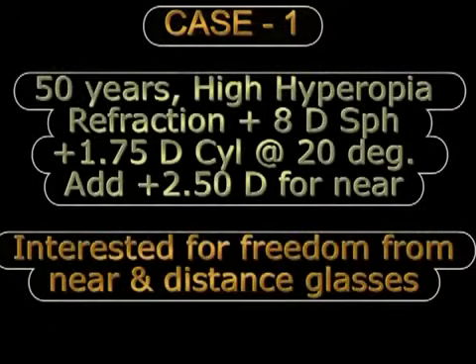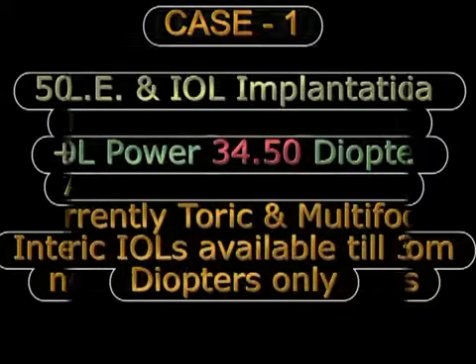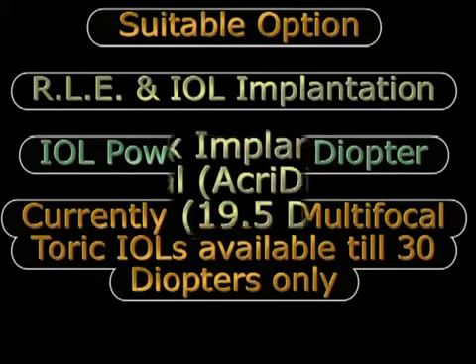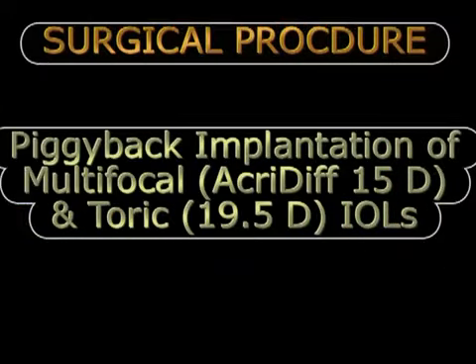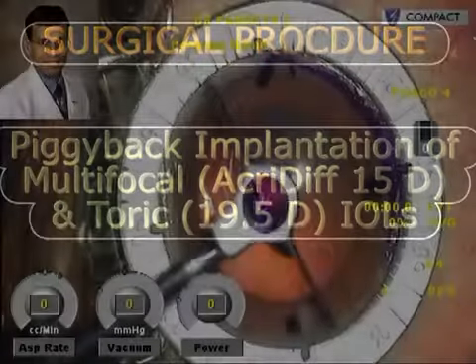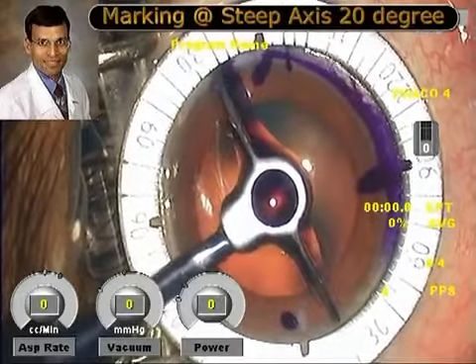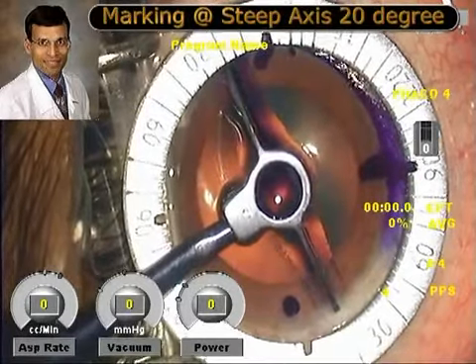This is a case of high hyperopia with a refraction of plus 8 diopters sphere who wanted freedom from glasses. The IOL power calculated was 34.5 diopters, and because toric and multifocal toric IOLs were available only up to a power of plus 30 diopters, a piggyback implantation of a multifocal and a toric IOL was done to achieve spectacle independence. The surgery is being performed with marking of the steep axis as is routine practice for toric IOLs.